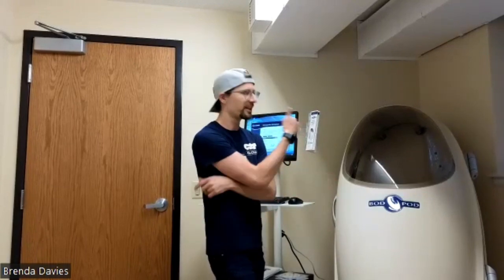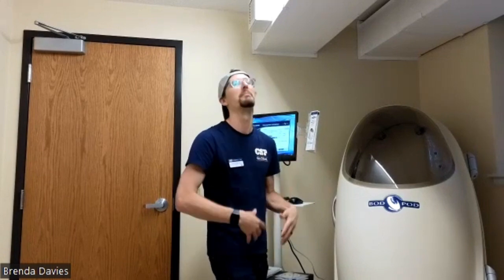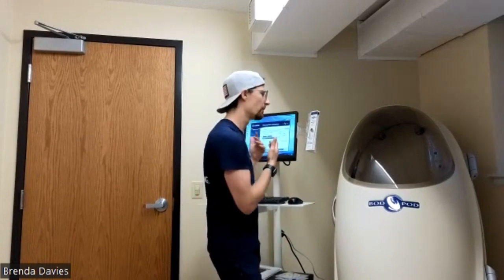And sometimes there's shifting in the movement of the client. Sometimes it's the breathing pattern. Sometimes, like I've had with large groups of classmates in here, they'll be taking photos and putting stuff on Instagram and Snapchat, and the person inside starts laughing. It doesn't become accurate because they're having massive changes in airflow. So the prompt to relax, to limit movement, to breathe normally, those are really important to hold steady, because otherwise each of those different assessments will give different values for the volume.